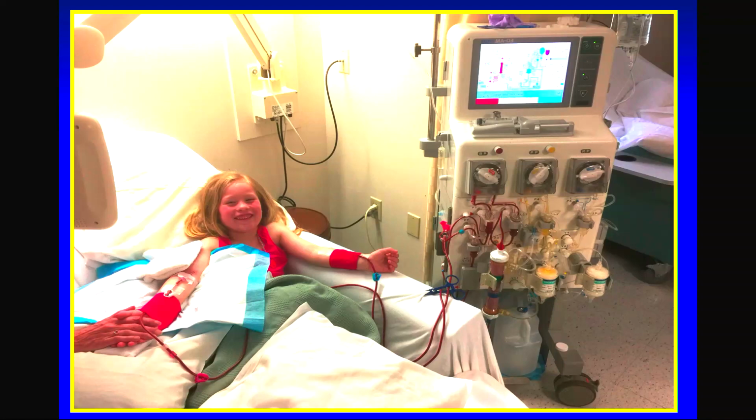So we put her on apheresis. It was tough in the beginning because we tried vein to vein, then we had to do a fistula on her, and she's been a trooper through all of this and has done very well. And now her baseline LDL before therapy is 450, and post is in the 60s. And let me show you, I asked Aubrey and her mother and her grandmother, which I'm going to bring up to you shortly after I show this, and about if I could show these slides, and they agreed.